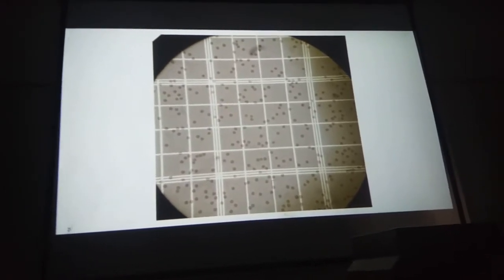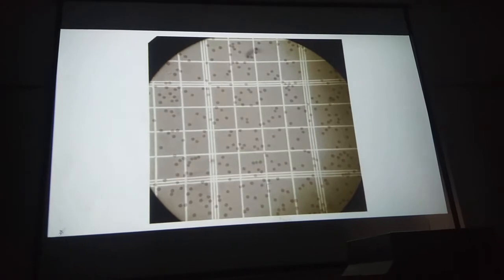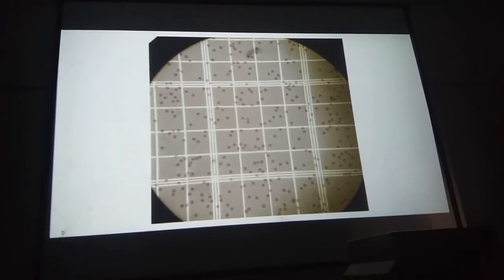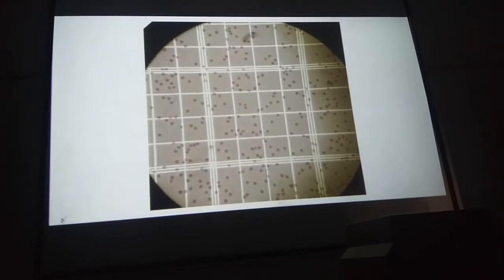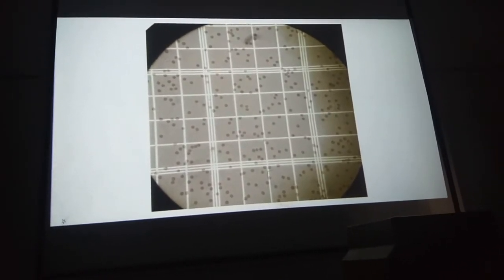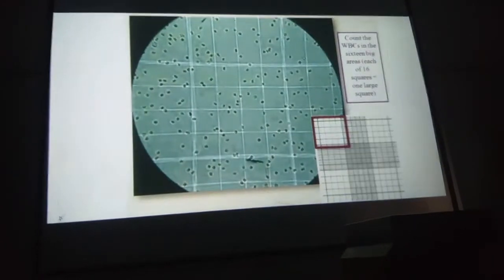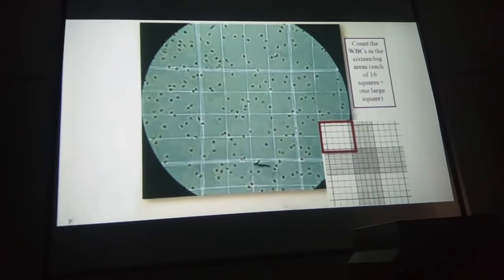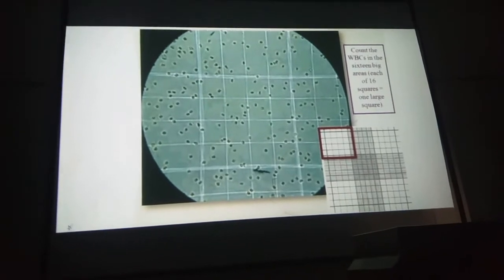This is how WBCs will appear under the microscope in a Neubauer chamber. You will first have to locate and focus the 4 corner boxes, and then start counting the WBCs in an inverted L manner in the 4 corner boxes. Here is another picture of how WBCs appear under the microscope.